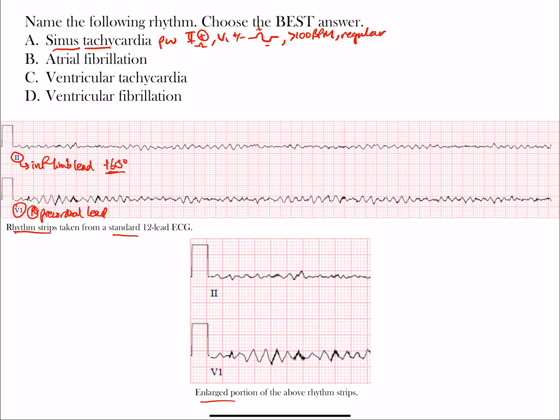Another feature of sinus rhythm is that it is typically a regular rhythm, unless you have an AV block. With atrial fibrillation, you do not see clear P waves because the atria are fibrillating rather than contracting clearly. What really helps identify atrial fibrillation is the irregularly irregular rhythm. There are other irregularly irregular rhythms such as multifocal atrial tachycardia or wandering atrial pacemaker, but the most common one you'll come across is atrial fibrillation.